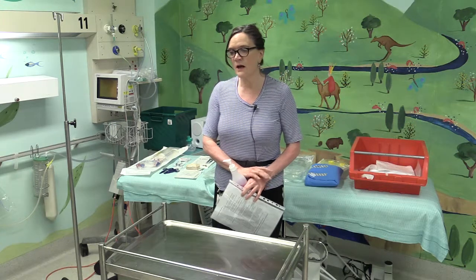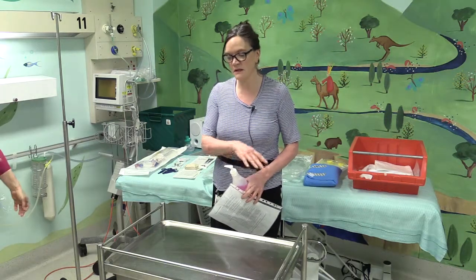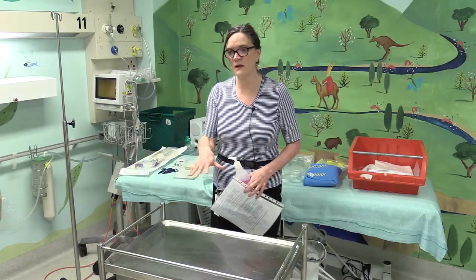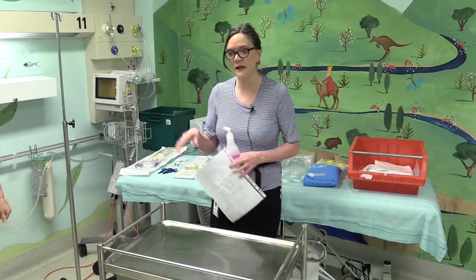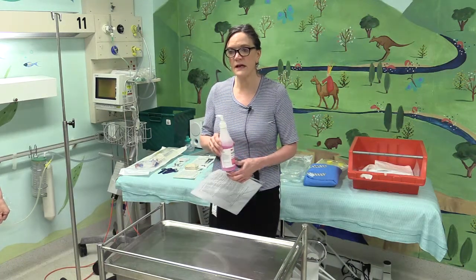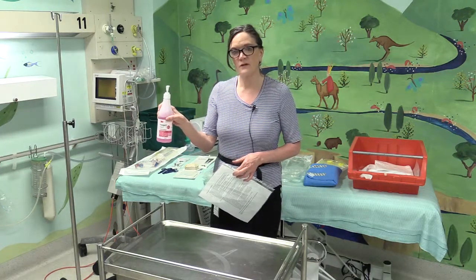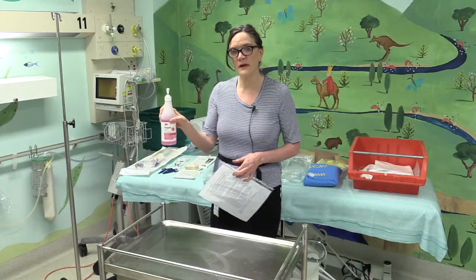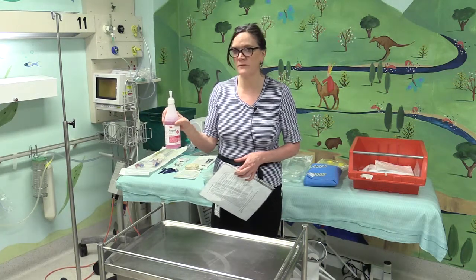I'm going to start setting up the dialysis set now. I will have an assistant. The assistant should wash their hands as well. They won't actually be touching the aseptic area, but they will be handing things to me and hanging my bags up when I require that to happen. So just a hand wash, and then to have some antiseptic hand rub available for extra hygiene to complement the hand washing, and that will be available in the dialysis packs.